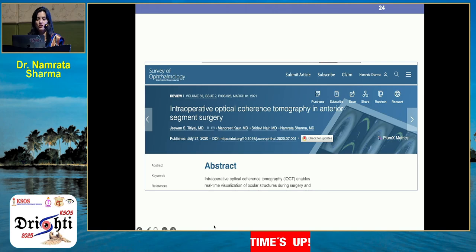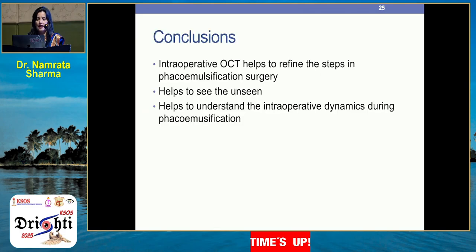This was a review article in Survey of Ophthalmology on IOCT guided anterior segment surgeries. And I think it really helps. I know it's expensive, but I'm sure Indian companies are coming out with their indigenous models, and it will be affordable very soon.